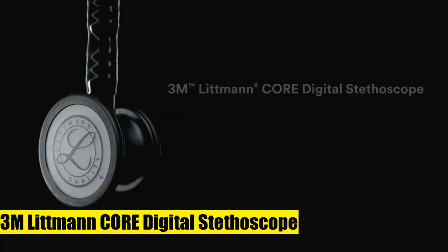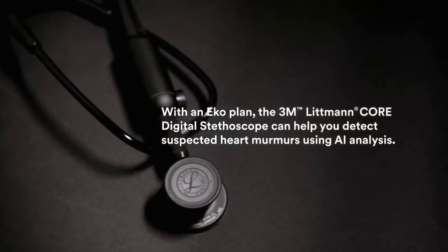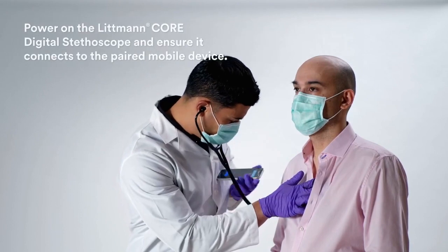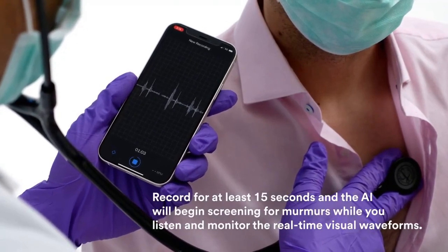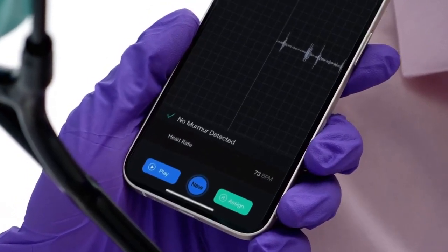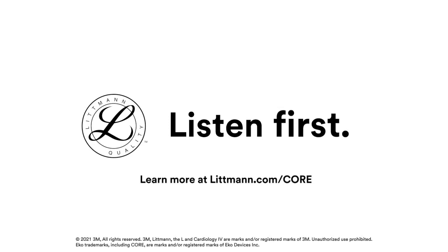3M Littmann Core Digital Stethoscope — Black Chestpiece, Tube, Stem, and Headset. Connects to Eko software to visualize and share heart sound waveforms (smart device not included). Up to 40x amplification at peak frequency versus analog mode. Active noise cancellation reduces unwanted background sounds. Toggle between analog and amplified listening modes. Soft-sealing ear tips provide an excellent acoustic seal and comfortable fit. Tunable, dual-sided stainless steel chestpiece with open or closed bell.